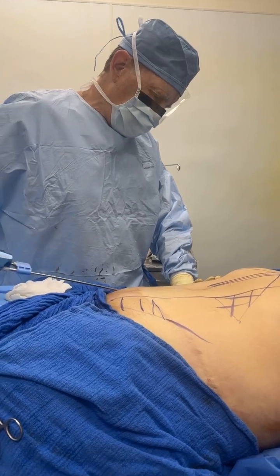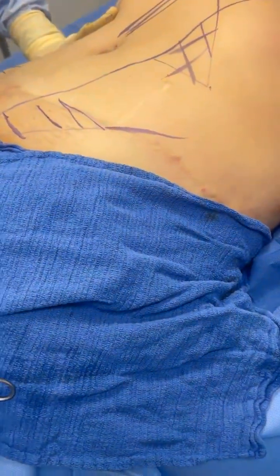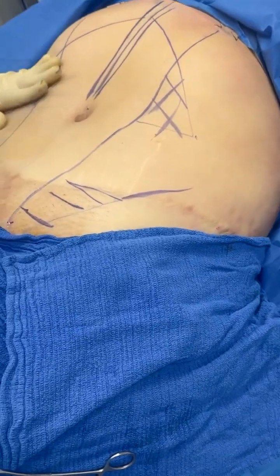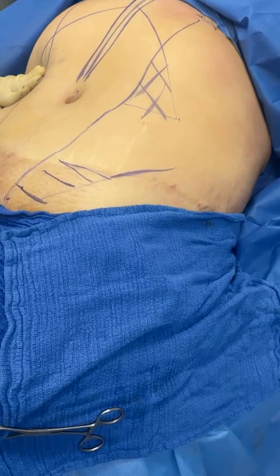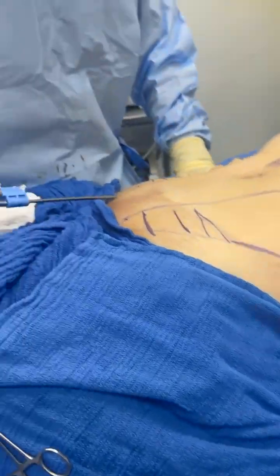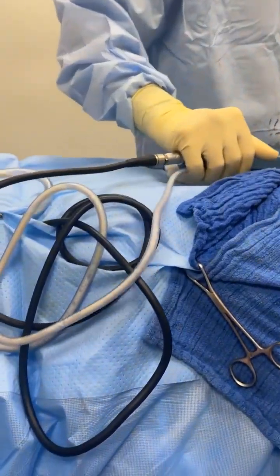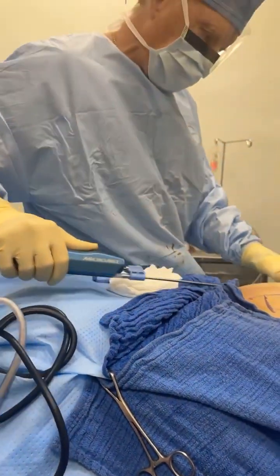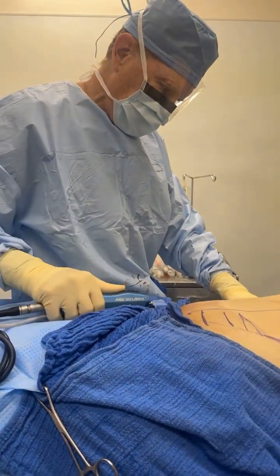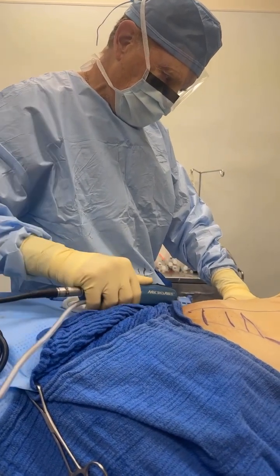Kimberly, now what do you see that I do on the liposuction part that is different from what you've seen other doctors do? Well, I do see that you let the tumescent absorb for the adequate amount of time so you get that maximum penetration, so you get optimal results when you're doing the lipo. Wow. And so when you hold the cannula, you're making sure it's at the surface level. You're using your other hand to counterweight so that you know you're in the right area when you're doing the lipo. You're in that subcutaneous area where you want to withdraw all the fat.